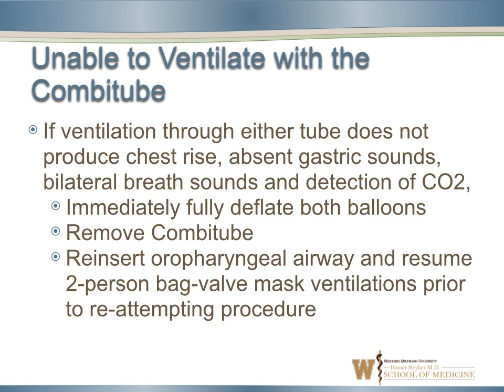If you find a condition where you're unable to ventilate at all with the Combitube, the tube does not produce chest rise, there's absent gastric sounds, you lack bilateral breath sounds or detection of CO2, immediately fully deflate both of the balloons, remove the Combitube, and reinsert an OPA and resume two-person bag valve mask ventilations prior to reattempting the procedure.